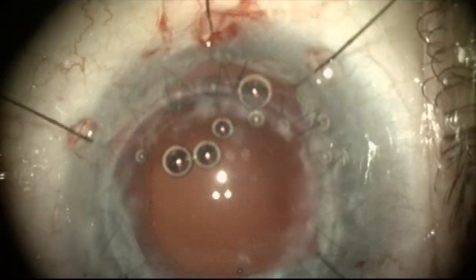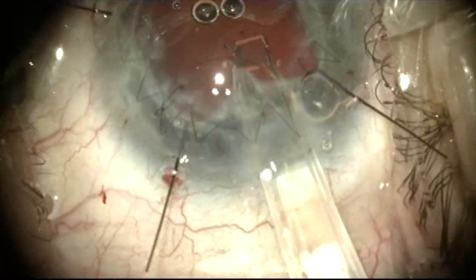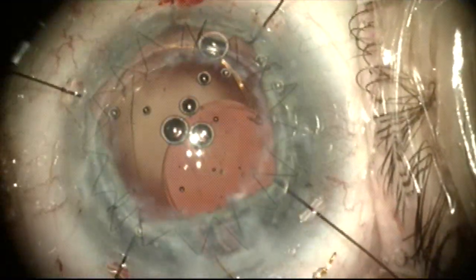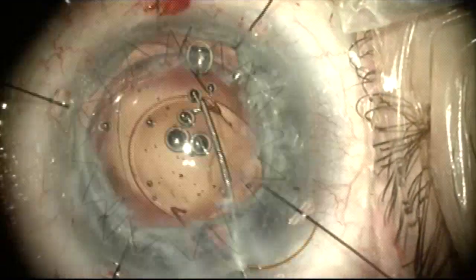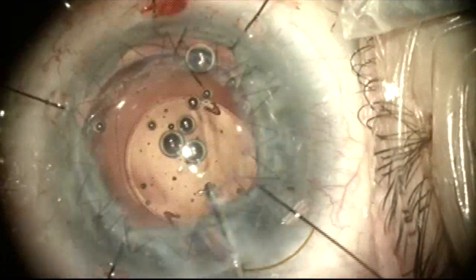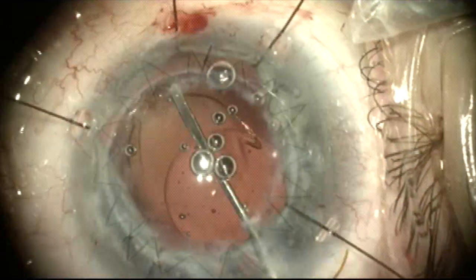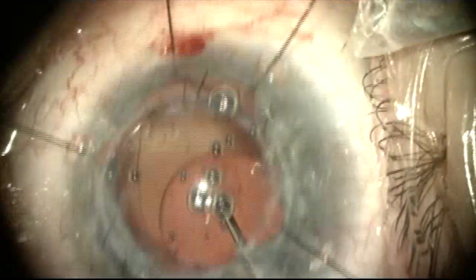The question arises how to secure the lens, as the sulcus on this patient is too large for sulcus fixation of an implant. I made the decision to use a STAAR silicone lens as this has a long haptic length, inject the lens inferiorly, and then manipulate it into the capsule bag as gently as possible trying to prevent the capsule bag from splitting further. Here I'm injecting the first part, leaving the trailing haptic out, and now I will as gently as possible try to tuck the leading haptic under the anterior capsule rim but not through the tear in the posterior capsule.